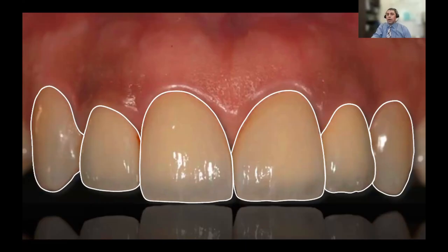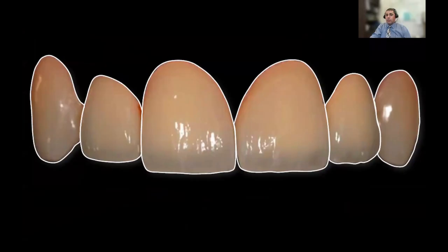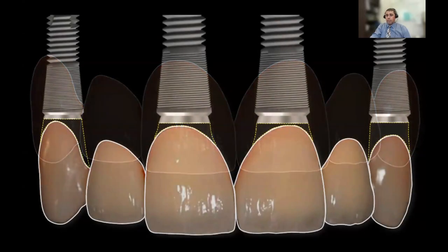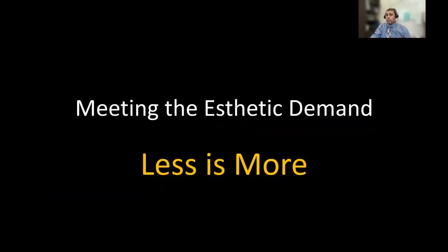And generally, it's very hard to achieve that by having adjacent implants, particularly something that's very close to each other, because that can result in bone loss between the dental implants. So we can actually achieve that by placing less number of implants and the utilization of Pontics following the guideline that we just discussed. Placing the implants about 3 millimeter deep, 2 millimeters to the palatal, use the right size of implants. So in this case, probably wider implants for the central incisor or the canine, maybe narrower implant for the lateral incisor if that's the case, and utilizing Pontics, particularly ovate Pontics in the anterior segment with the proper placement can result in very good outcomes.